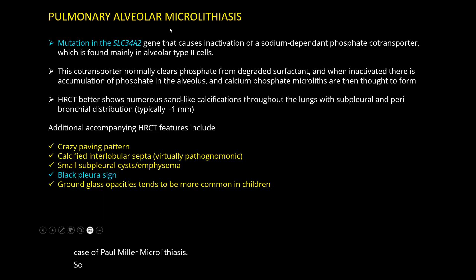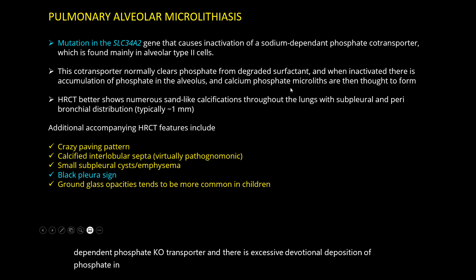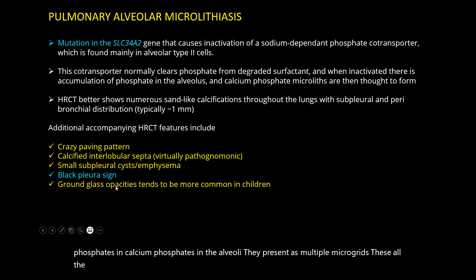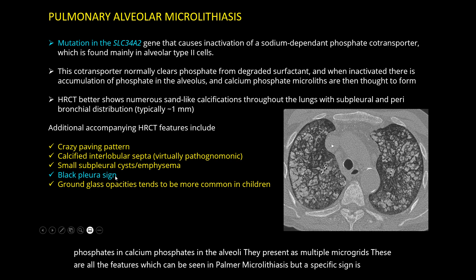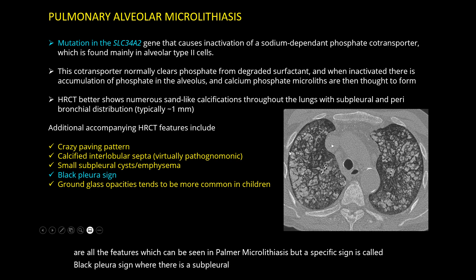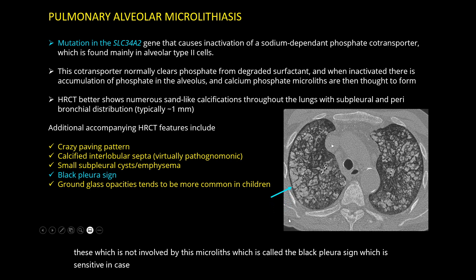There are densely calcified nodules scattered in bilateral lung fields — this is a classical case of pulmonary alveolar microlithiasis. This condition occurs due to mutation in the SLC34A2 gene, which encodes a sodium-dependent phosphate co-transporter, leading to excessive deposition of calcium phosphates in the alveoli, presenting as multiple microliths. A specific sign is called the black pleura sign, where there is a subpleural zone of lung that is spared from these microliths — this is sensitive and characteristic of pulmonary alveolar microlithiasis.